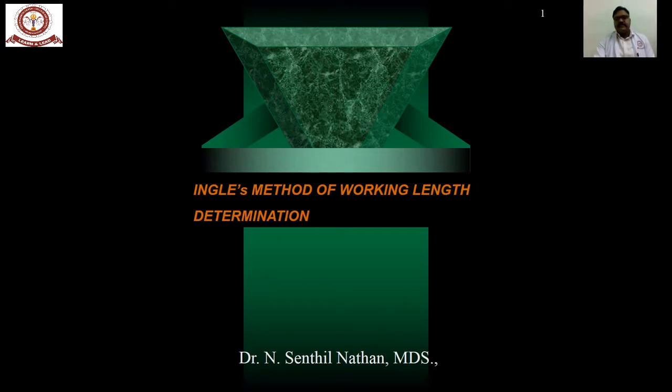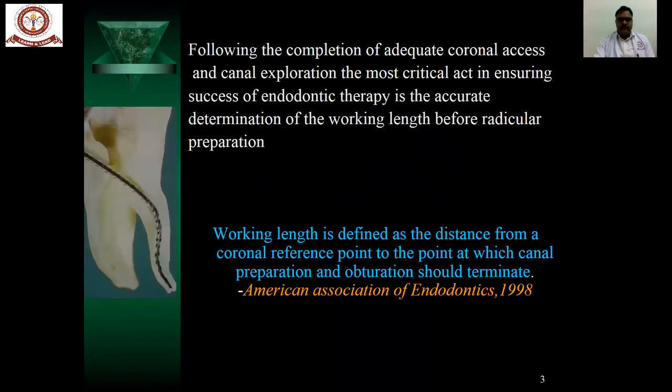Today's topic is on Ingle's method of working length determination. Following the completion of adequate coronal access and canal exploration, the most critical act in ensuring success of endodontic therapy is the accurate determination of the working length before you go for radicular preparation.